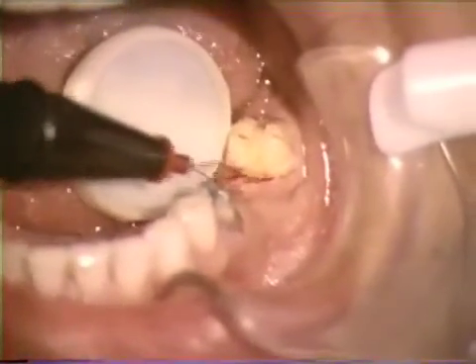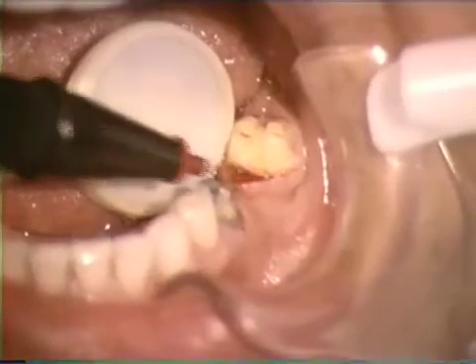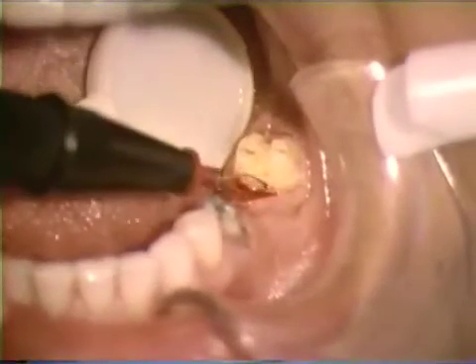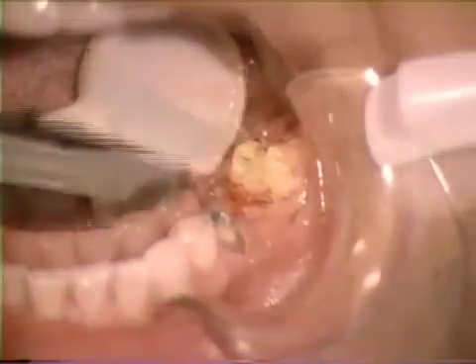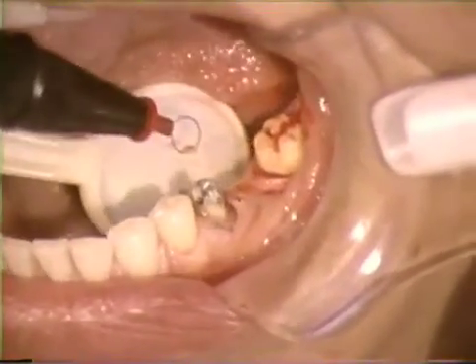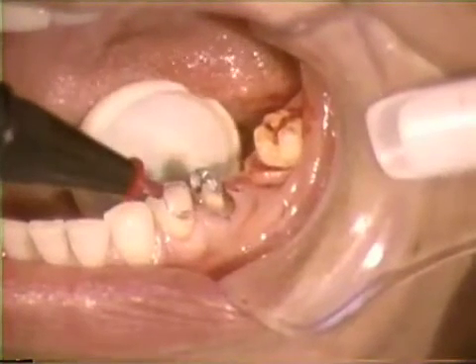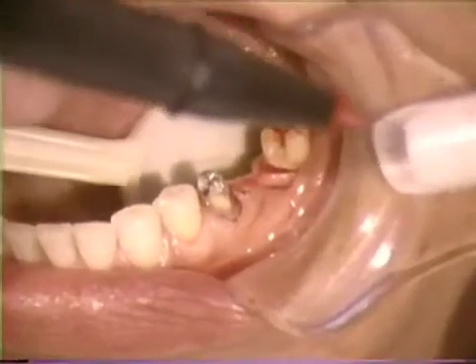Tissue should be easily removed from the electrode after cutting. Adherent tissue usually signals a need for current adjustment — accordingly, the current must be increased. Excess tissue can be shaved in layers and contoured to allow for adequate pontic space and later access for margin cleansing during home care routines.